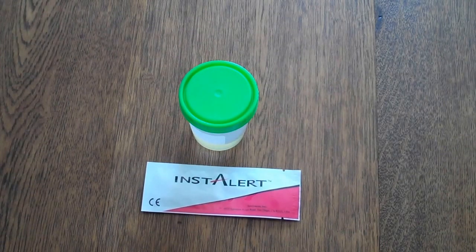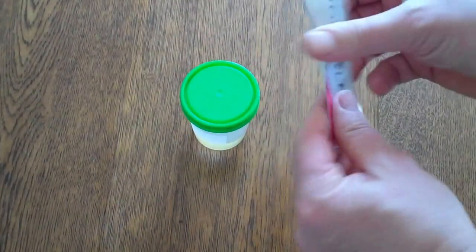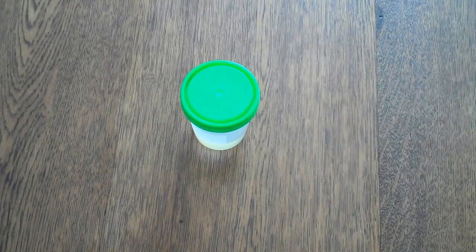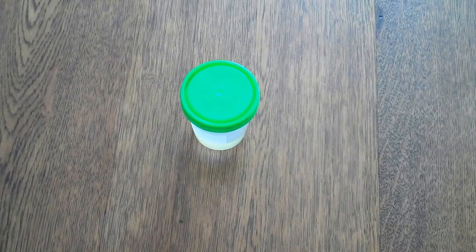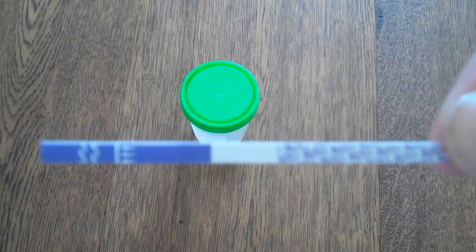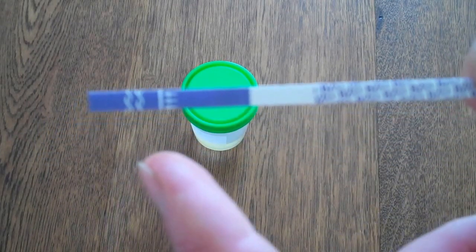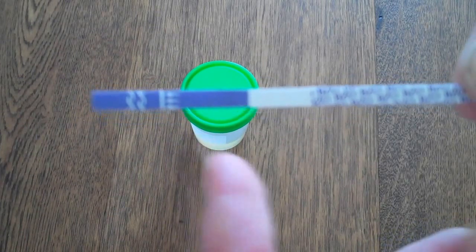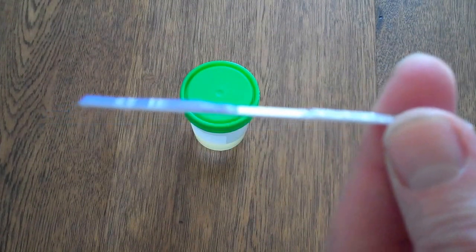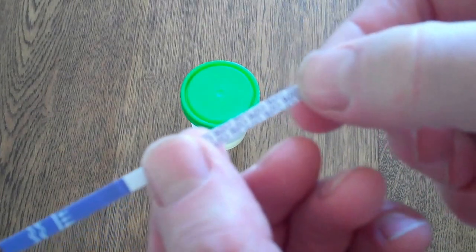So to perform a test when you've collected your urine sample that we have prepared here, all you have to do is open the foil and remove the test strip. And here we have our test strip. If I bring that nearer to the camera, you'll see that you have a coloured dip end with some wavy lines indicating the fluid, the maximum dip line indicated by the arrows, a narrow central section where the test and control lines will come, and actually on the handle end the coding for benzodiazepines BZO.